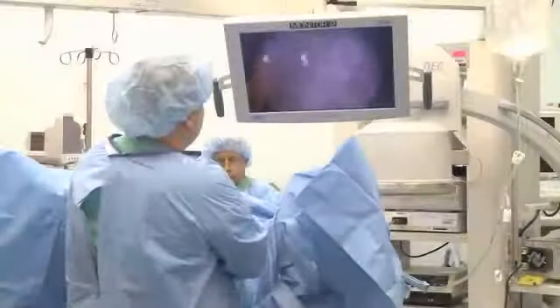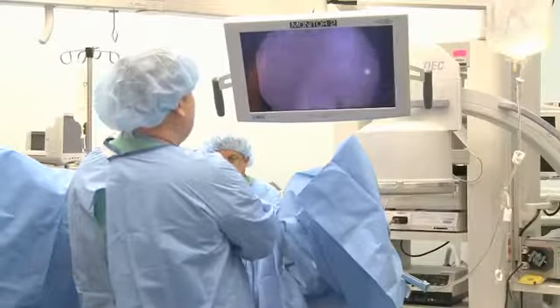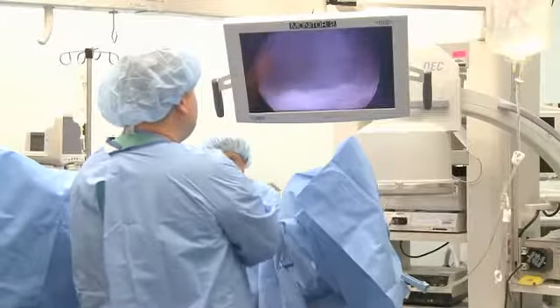So far I don't see any bladder tumors. There's some debris in the bladder. So just surveying his bladder. So far I see no cause for the blood in the urine. Although again, he's got hormone refractory prostate cancer. Now there's a little dystrophic calcification.